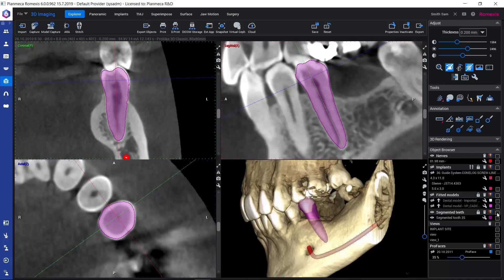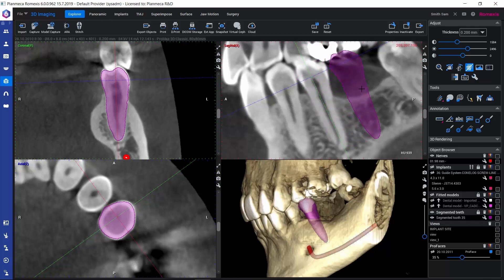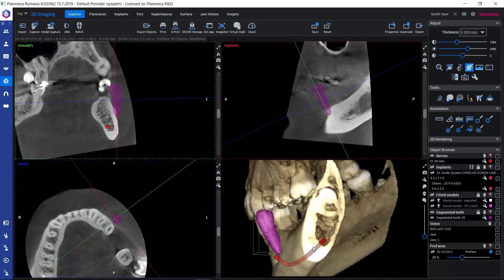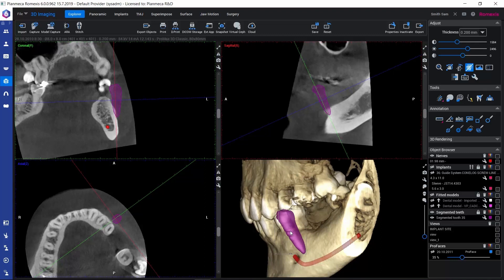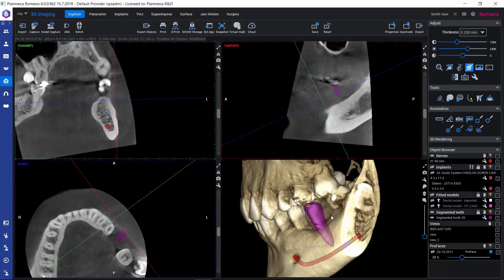If we would like to lock the tooth in place so that we don't accidentally move it, we can select it and use the lock icon. But if we would actually like to move the tooth in the data, we can deactivate the lock. We can simply grab the tooth in the slice views, or use the 3D rendered view for moving it. To move the tooth in the 3D rendered view, we need to keep Ctrl and Shift down on the keyboard — these controls are for Windows — and use the left mouse button to move the tooth around.